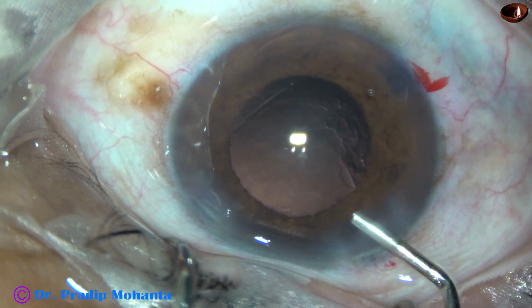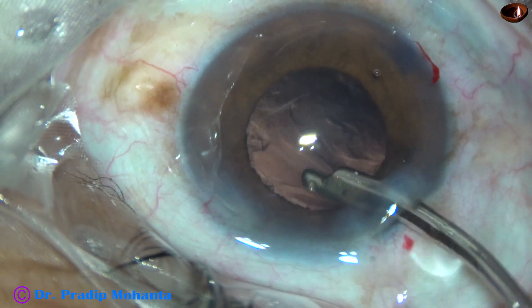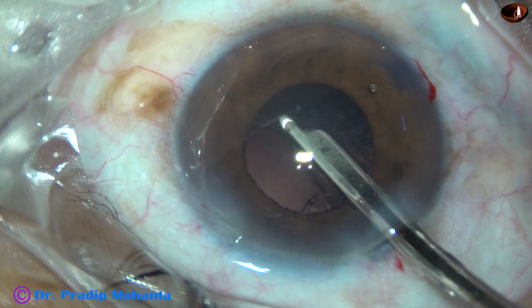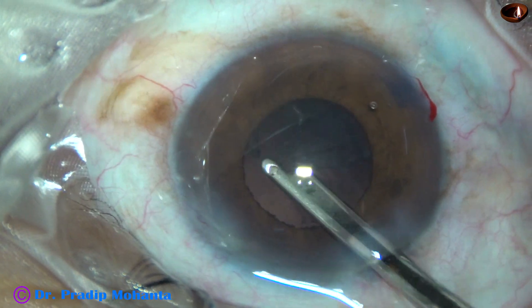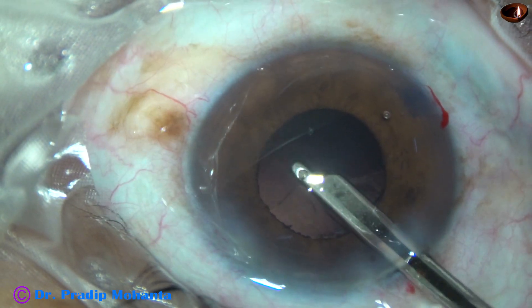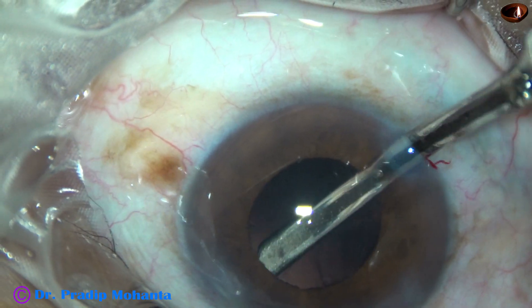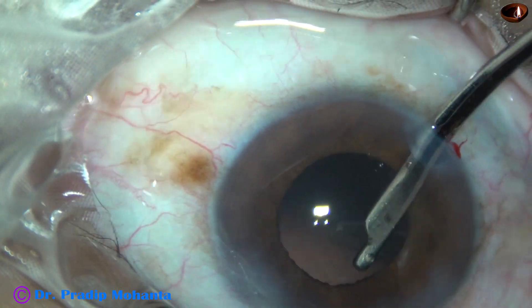Visco is injected, and in this case I used a 23G Simcoe cannula to remove the cortex. You can see there is a thin layer of cortex covering the posterior capsule, and we have to very patiently remove this thin sheet of epinuclear cortex. We go through the side ports to remove the sub-incisional cortex. This 23G Simcoe cannula goes through a small side port.